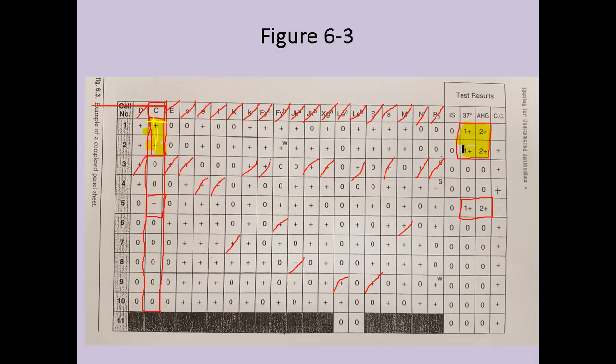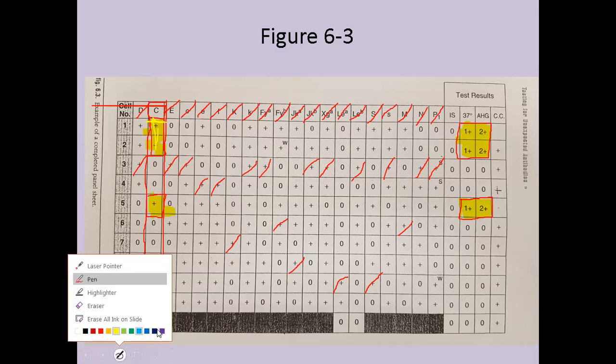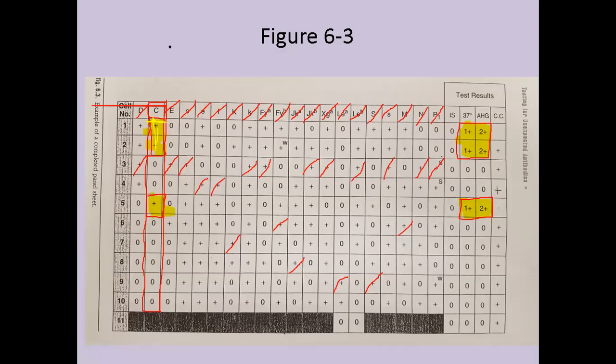And sometimes students, if you decide to print some of these out and do it by hand, it's hard to color in this, but we could see how it's a perfect pattern match. And we're going to call this anti-C. Let's see how well I write today. It's nothing like my real handwriting.